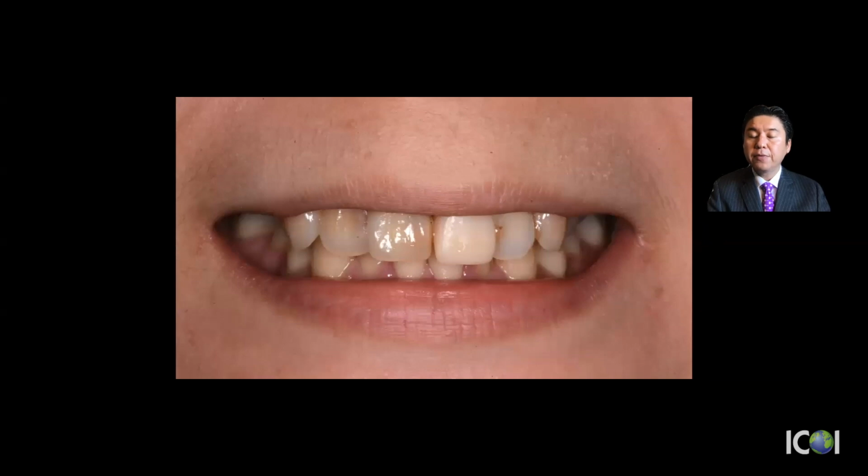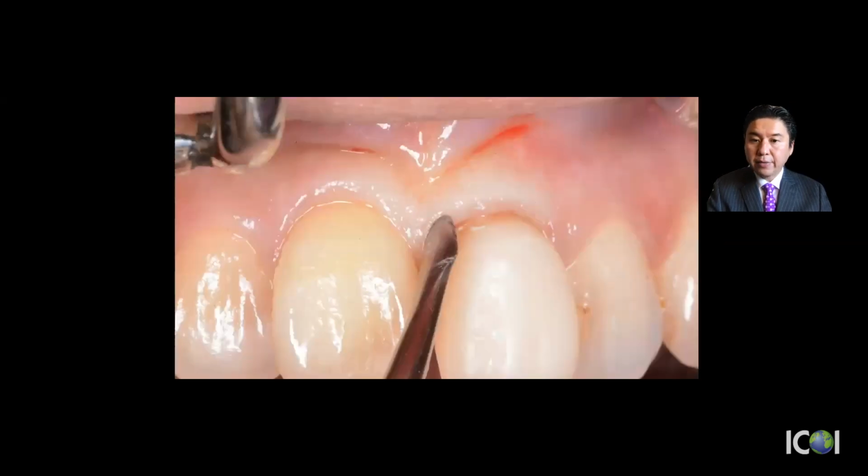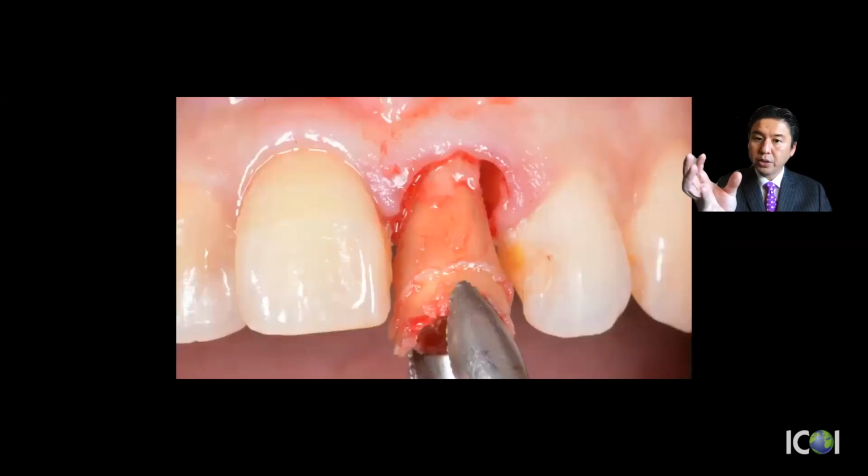The patient had endodontic failure on the left central. Okay, you can see the pus coming out on the pulpal side, and then she did multiple root canal treatments, but she ended up with pain, and then she decided to take out the tooth and do the next step. So I carefully took out the left central with rotational movement. Okay, you can see the fracture line over here, so you don't see periodontal ligament, only this area. So the fracture had happened.